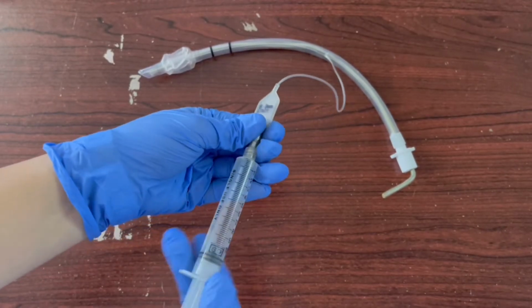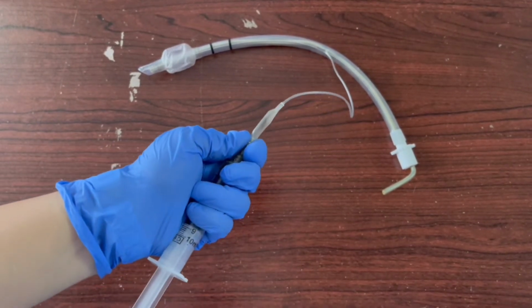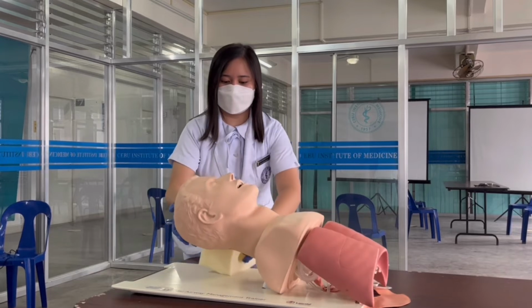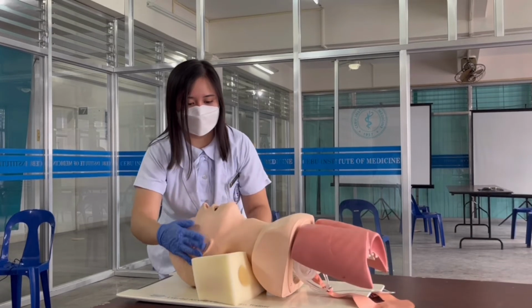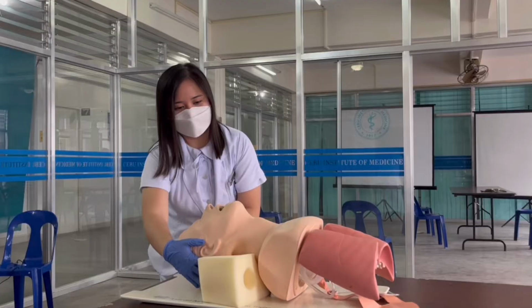After preparing the materials, check the patency of the tube by inflating it and then deflating it right after. Positioning of the patient. Position the patient in a sniffing position by placing a pillow or a towel under the patient's head. A combination of neck flexion and head extension is considered suitable for endotracheal intubation.